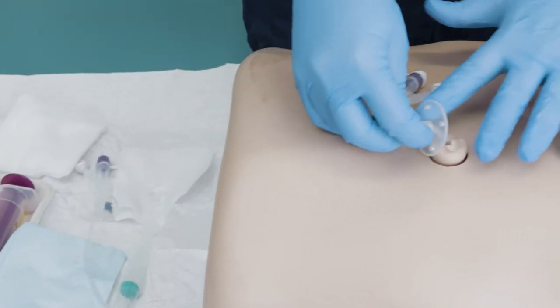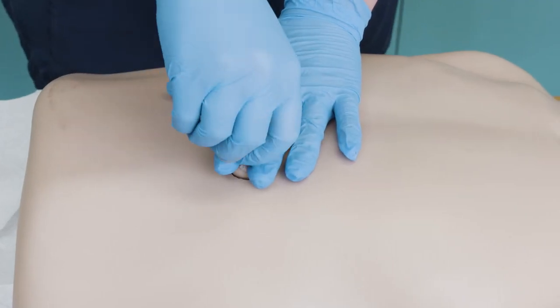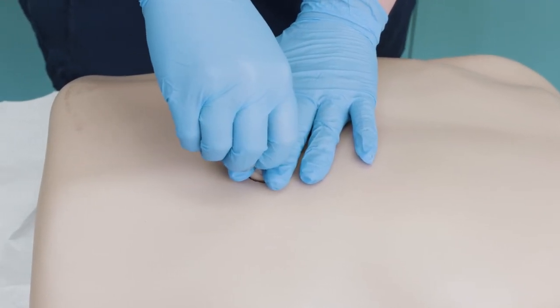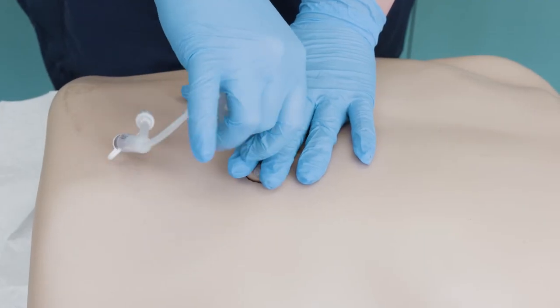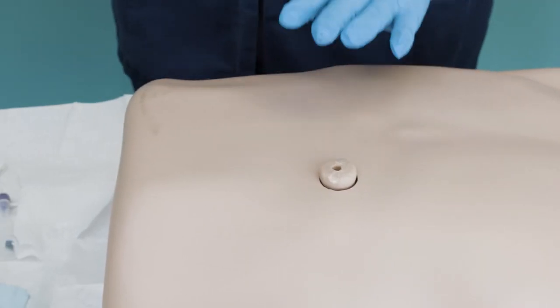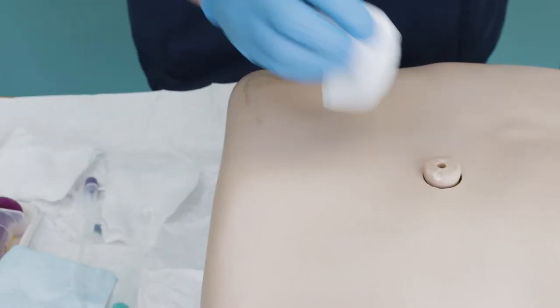Remove the old tube by using one hand to press gently downwards on the abdomen around the tube and the other to gently pull the tube. Clean the skin around the stoma to remove excess fluid or blood and dry thoroughly.